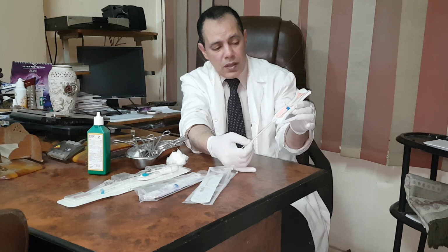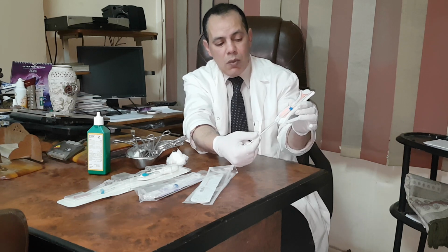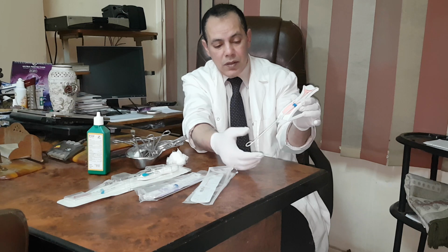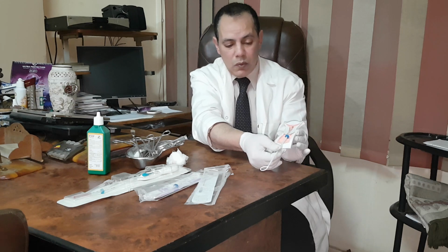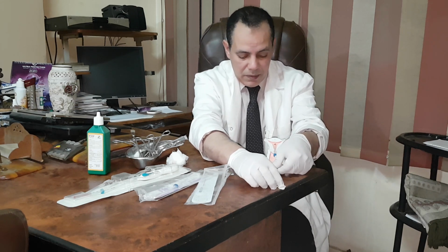Just touching the fundus, a little bit below it, withdrawal. Then I do withdrawal of the sheath. I'll fix one hand fixing the plunger, and the other hand will do withdrawal of the sheath. So, like that.